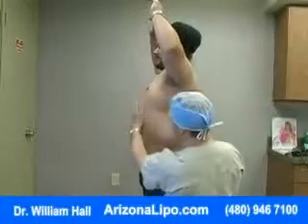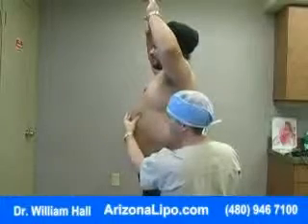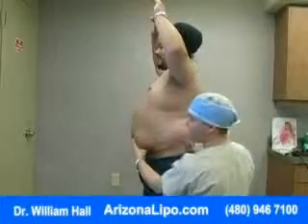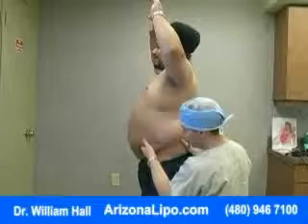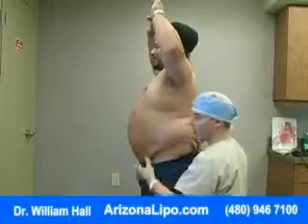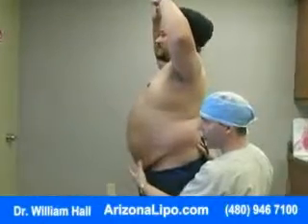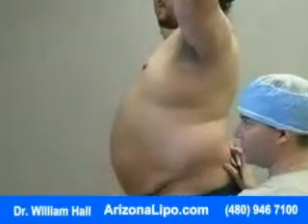Okay, so a lot of this fat that you have up in here, we really can't do anything about because that's all the fat that's inside your belly. We can't squeeze very much. When we talked about this part right here, which we call the pannus, we're going to completely remove this with lipo. And you won't have hanging skin afterwards. Oh, good. This skin will retract right back up like this, so it'll be fairly tight up against your abdomen when we take the fat off. Oh, good. The only thing that's keeping the skin hanging down is the weight from the fat. Without the weight, gravity can't take effect, and hence the skin won't hang.